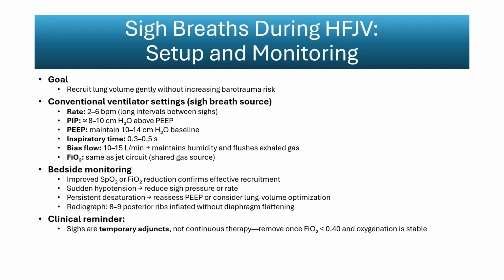Sigh breaths are temporary and should be removed once the lung is stable. Prolonged use increases mean airway pressure and can negate the protective advantage of the jet. Their role is to assist recovery from partial derecruitment or handling events and then return control of ventilation and oxygenation to the coordinated jet conventional system.